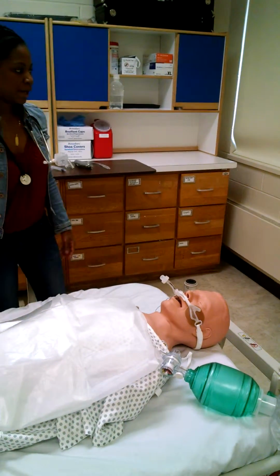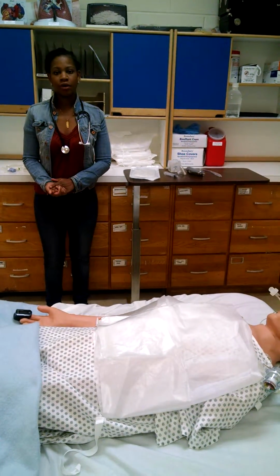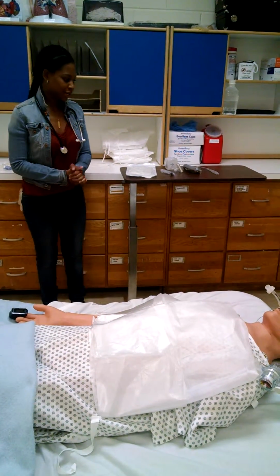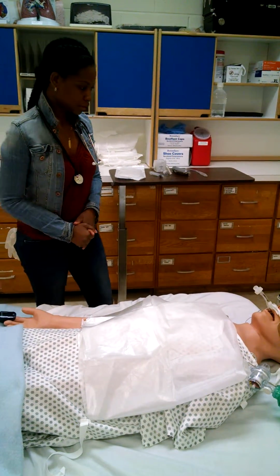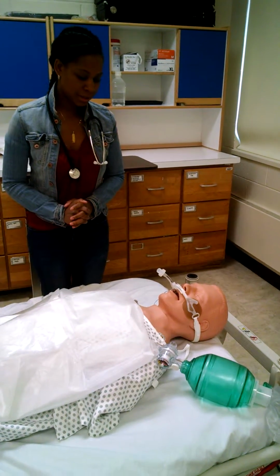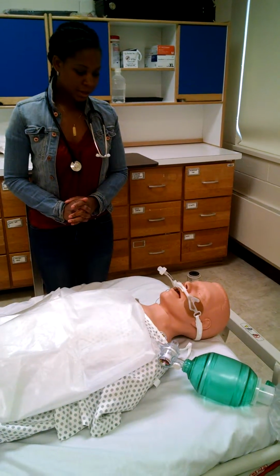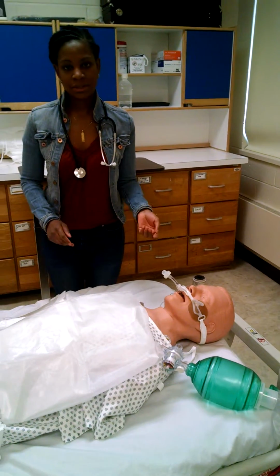Now I'm going to go ahead and wash my hands with 3 milliliters or more of an alcohol-based hand sanitizer. Now I'm going to introduce myself to the patient. Hi, my name is Brittany. I'm a respiratory care student, and I'm here to perform suctioning. May I have your name and date of birth? If the patient can respond to give me his identity, I would check his wristband.